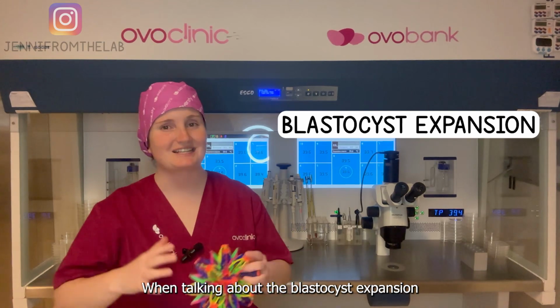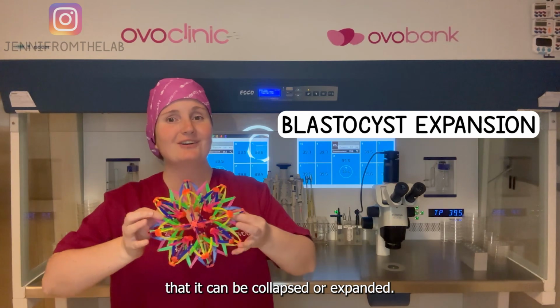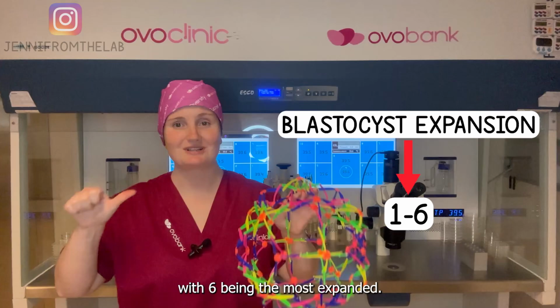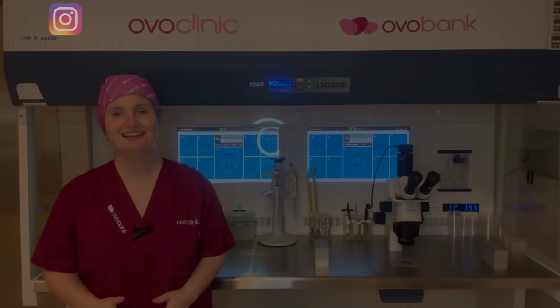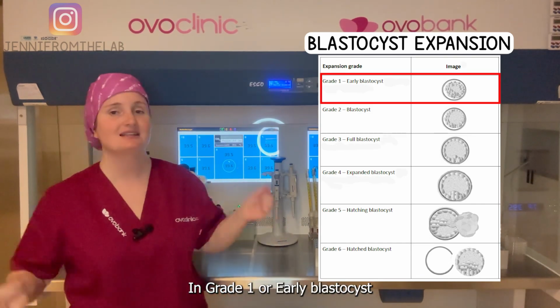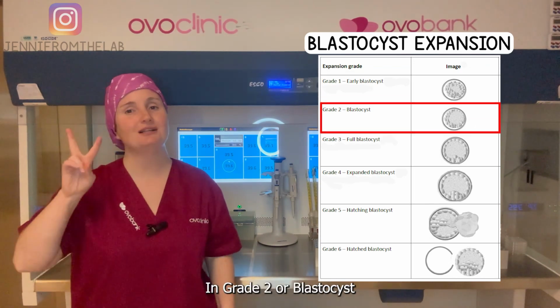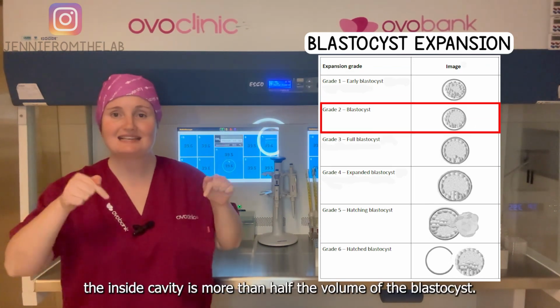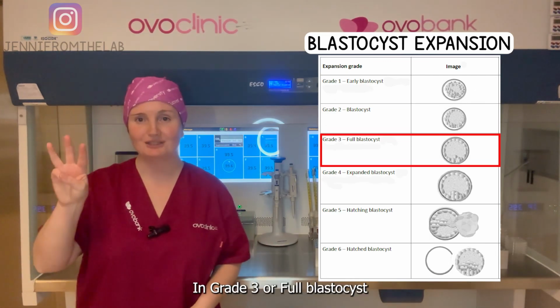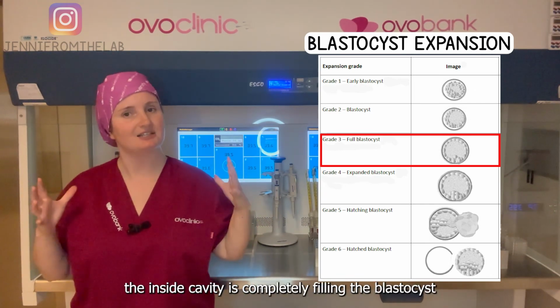When talking about the blastocyst expansion, we should imagine the blastocyst as a toy ball that can be collapsed or expanded, and the range of expansion goes from 1 to 6, with 6 being the most expanded. Let's talk about the grades of expansion. In grade 1, or early blastocyst, the inside cavity is less than half the volume of the blastocyst. In grade 2, or blastocyst, the inside cavity is more than half the volume of the blastocyst. In grade 3, or full blastocyst, the inside cavity is completely filling the blastocyst.